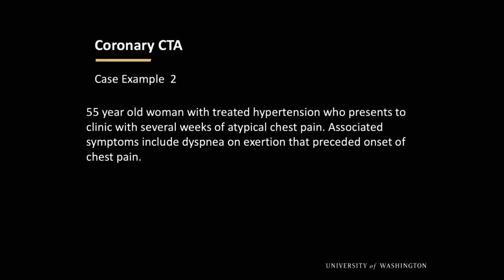So I just want to jump to a second case as we go into CTA. This is a very standard referral we get from our friendly primary care clinic colleagues, and it's a 55-year-old woman, treated hypertension, presents to clinic with several weeks of atypical chest pain. That's her main symptom. And then she mentioned she has some shortness of breath on activity that may or may not have started before the chest pain. So the question is, is a coronary CTA an option for her?